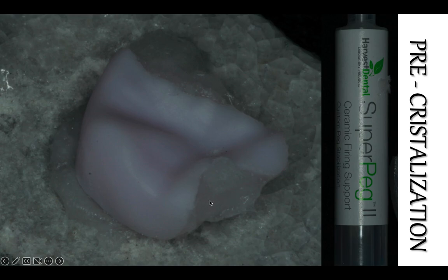restoration. Glaze is a spray or a semi-liquid material. When you glaze, the glaze will go inside of the intaglio on the margin, and it can show at the end after the firing, it will show up crispy. So the idea is that we protect with the firing support and we make sure that it's flush.